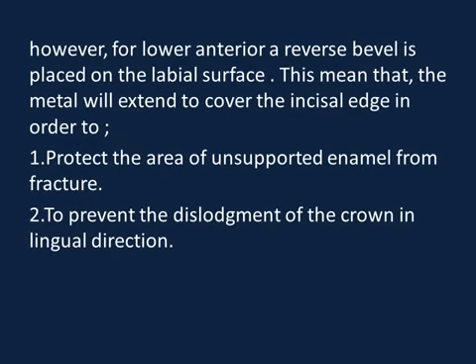But for the lower anterior teeth, a reverse bevel is placed on the labial surface. This means that the metal will extend to cover the incisal edge in order to protect the area of unsupported enamel from fracture and to prevent the dislodgement of the crown in the lingual direction.